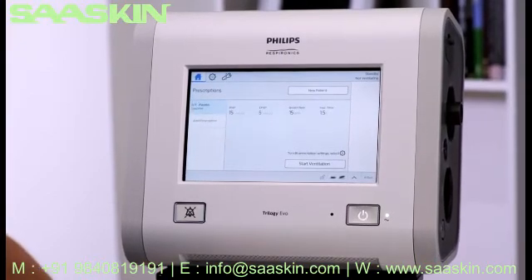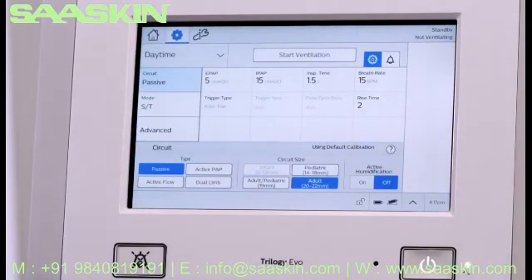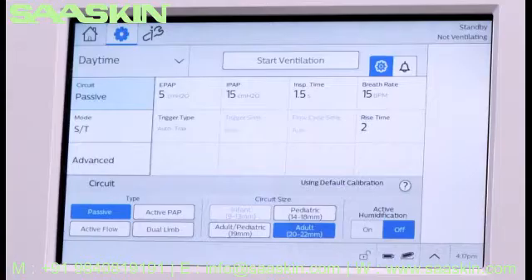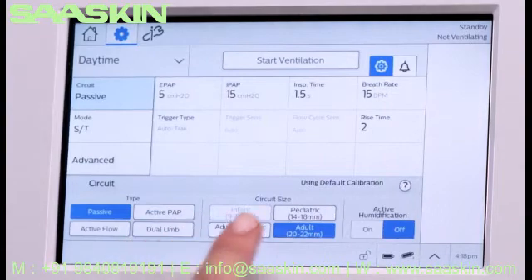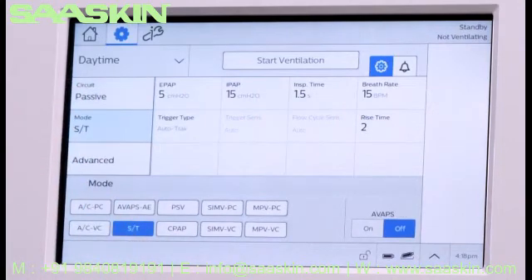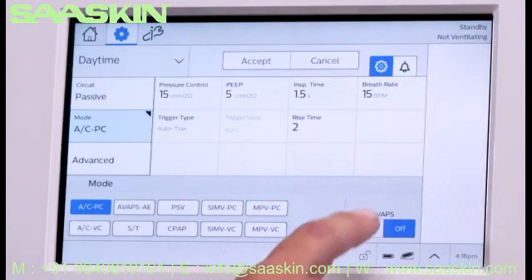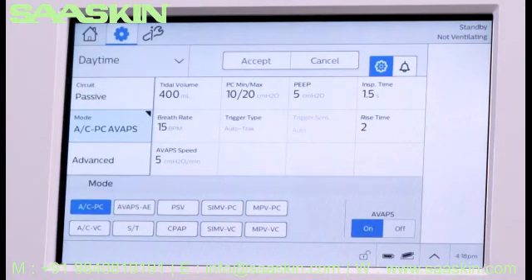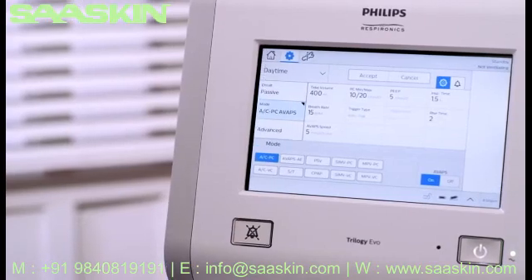If you need to edit the prescription before initiating ventilation, tap the Settings icon. In the Settings window, you can view and edit all the prescription and alarm settings. Circuit is highlighted in blue and setting options appear at the bottom of the window. Verify the circuit type, size, and humidification settings. Next, tap Mode and choose the desired ventilation option. In this example, we'll select ACPC Mode, which stands for Assist Control, Pressure Control, with AVAPS ON. Note the AVAPS ON-OFF option beside the modes — AVAPS is available in the ST, PSV, and ACPC modes.